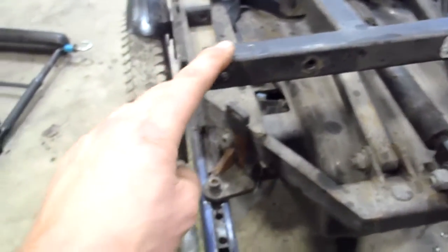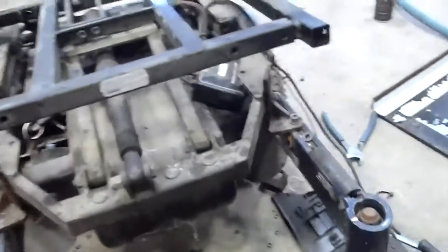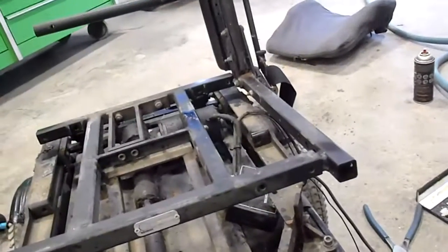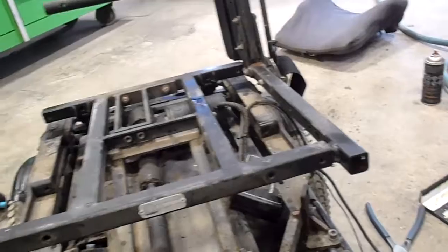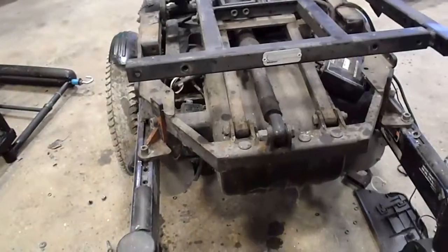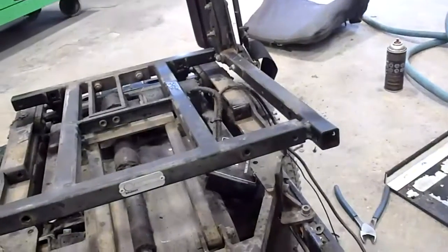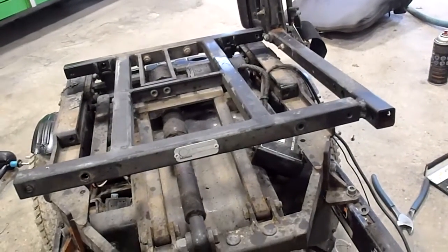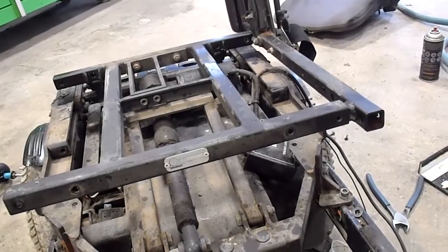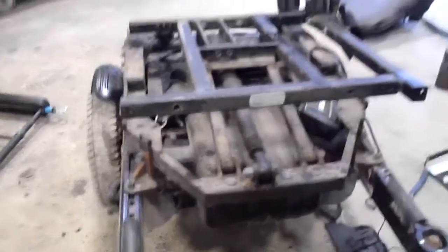Just looking at it here, I got to get this thing so it goes all the way down and sits flat. But I've also got some adjustment here for height, so it's kind of cool how they make these things so you can fit. When they say they can custom fit wheelchairs to people, that's what they're talking about: they can slide all these frames in and out and make it as wide or narrow or tall or short as they need for the person that's using it. And they charge you an exorbitant amount of money. So that's why I'm making this. This can all be done by somebody with a set of Canadian Tire sockets. All this is 1/4 inch hardware, just about all of it. Use a 7/16 wrench and a ratchet, and away you go. So I'm going to be documenting that as we go through this build. But right now I've got to get to work here. It's getting late.